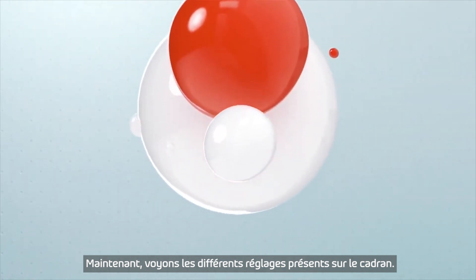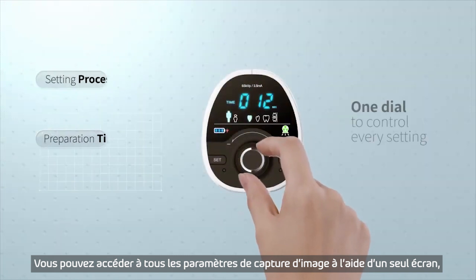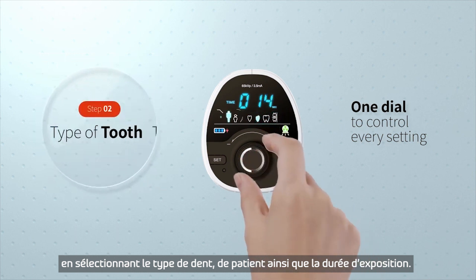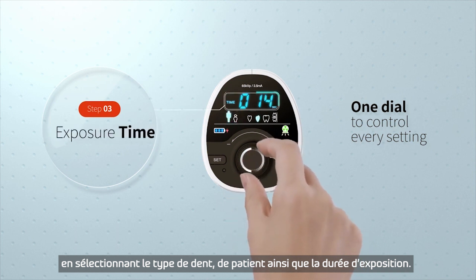Now, let's escape the difficulties of operating control panels. All settings for taking an image can be accessed using the one dial. Simply select type of tooth, type of patient, and the exposure time.